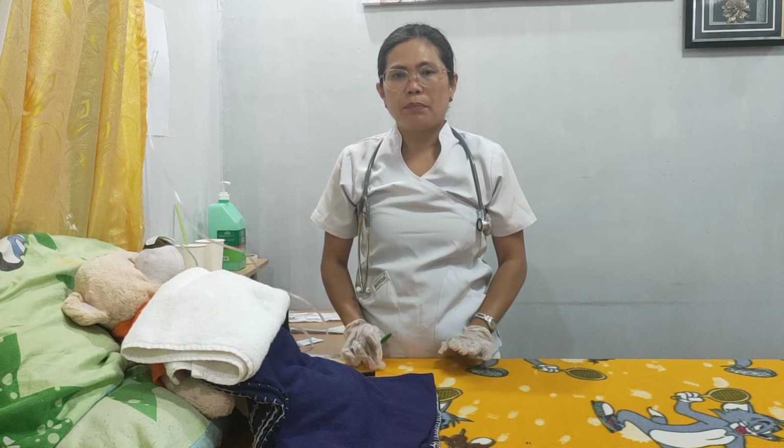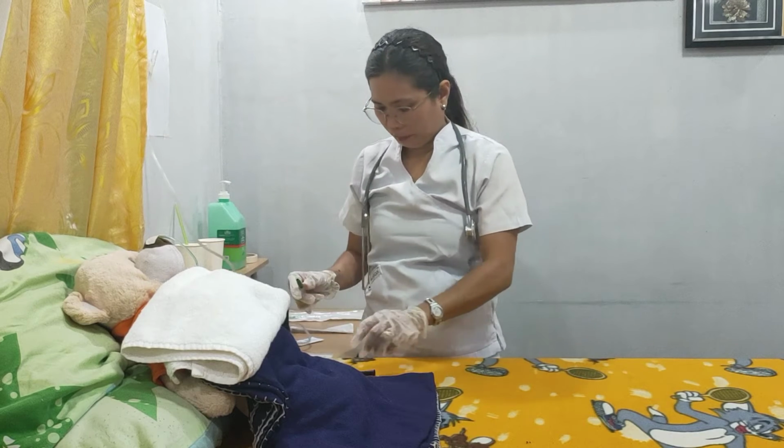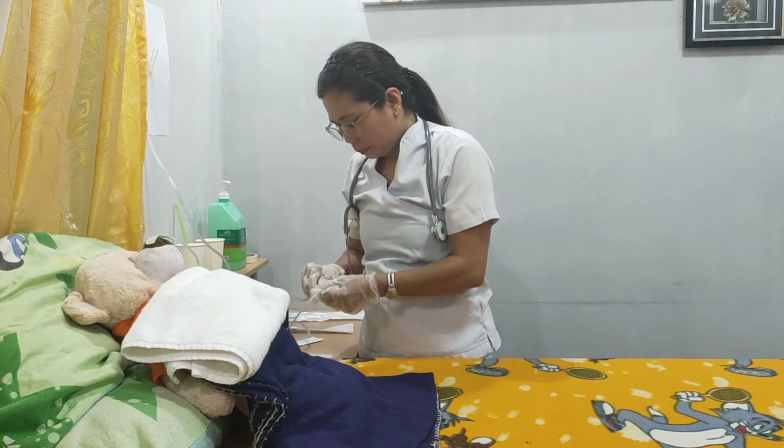Put the plug back in, then hook it up using a suction machine. Remove your gloves, then position the bed back down.